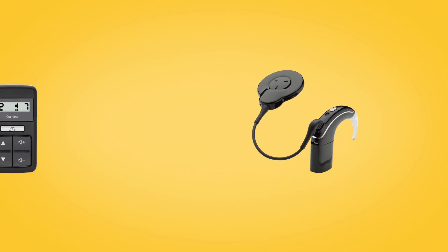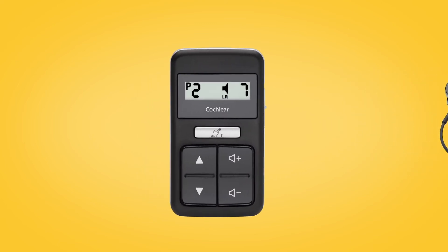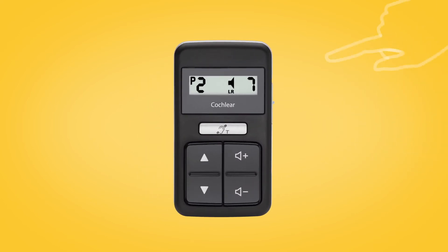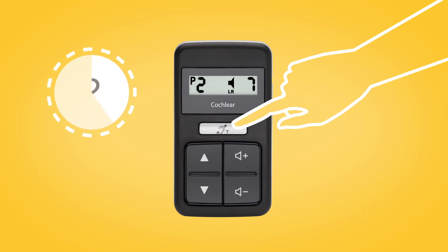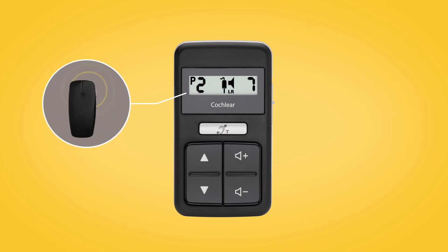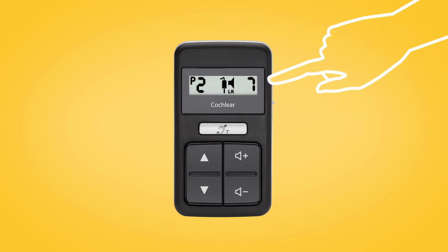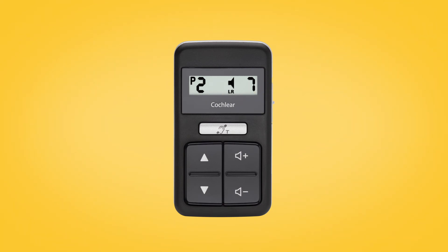You can also control and monitor True Wireless accessories using the CR310 remote control. Once paired to your Nucleus 7 sound processor, press and hold the silver telecoil button for two seconds, then release. Your processor will start streaming from your mini microphone or TV streamer and the accessory icon will appear on the screen. Press and hold again to select the next paired True Wireless accessory. To stop streaming, short press the telecoil button and the accessory icon will disappear.